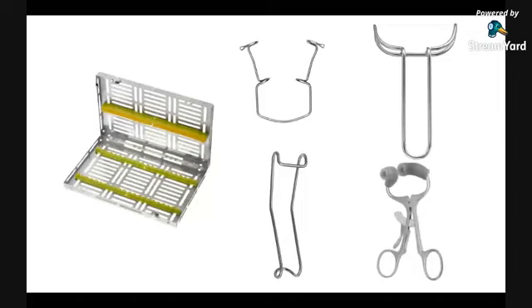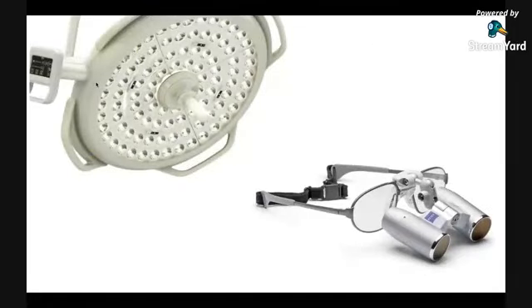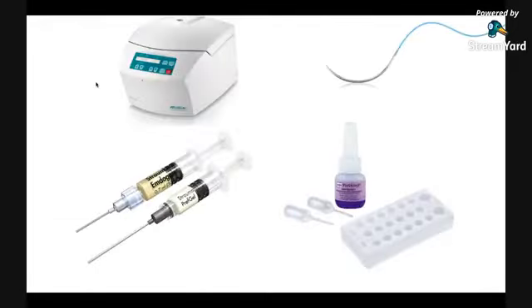You need these retractors, of course, to see it well and to have a lot of illumination, a lot of light in the surgical area. Some dentists use magnification glasses, a good illumination. And more with time, we are investing in new materials, like the PRF machine, new and better sutures, this Emdogain and Pref gel with EDTA.